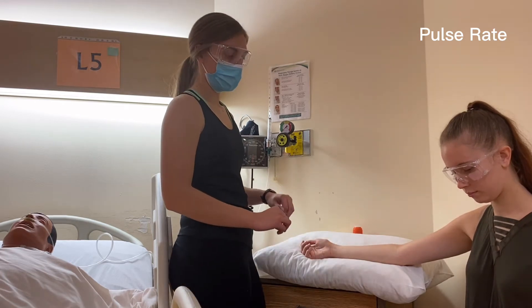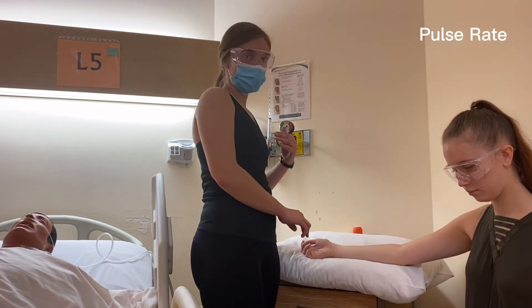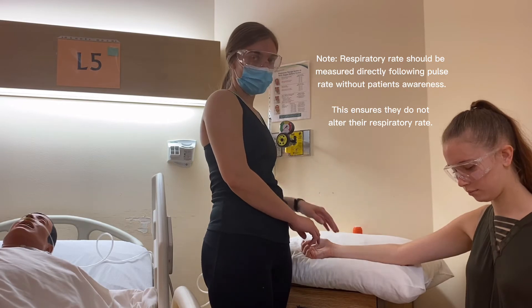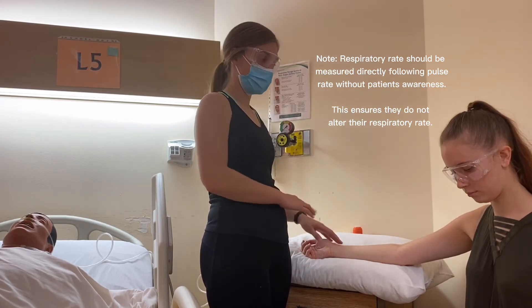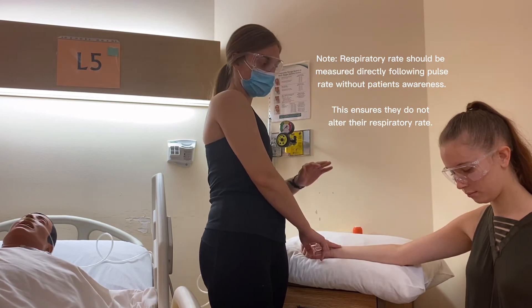Her pulse rate was 98 beats per minute. We take note of that, but before writing it down we'd check the respiratory rate. Had I not said anything, I would still be palpating but watching her chest rise and fall.